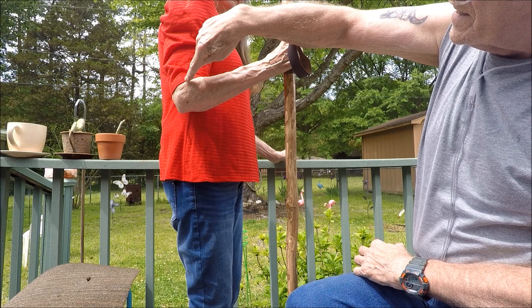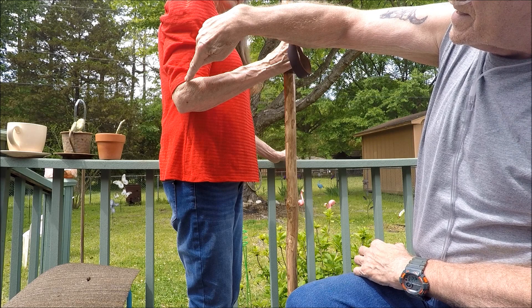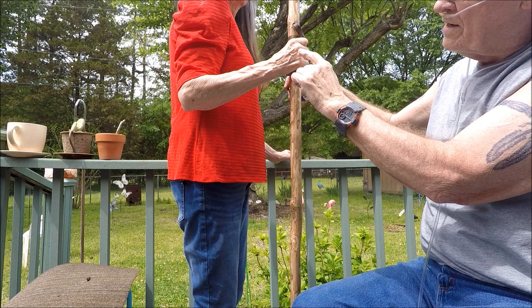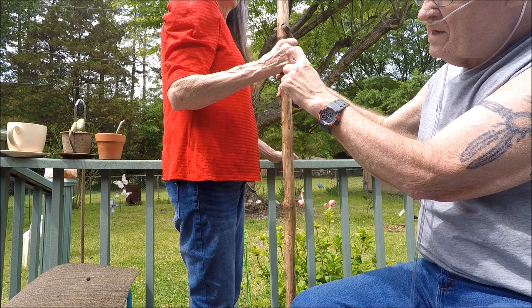With a slight bend in your elbow, you want to measure from the ground to the center of the knuckles. You have four knuckles — count down two or count up two. That's where you measure to, and that will be the height of the grip of your walking stick.